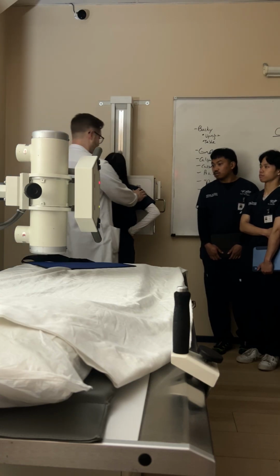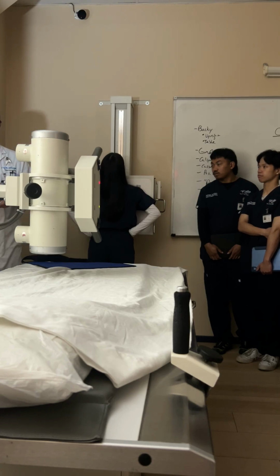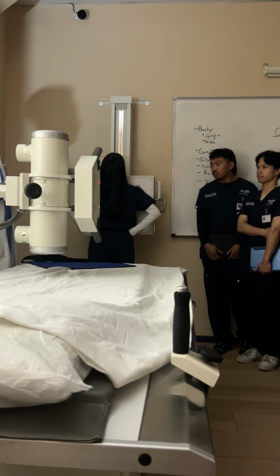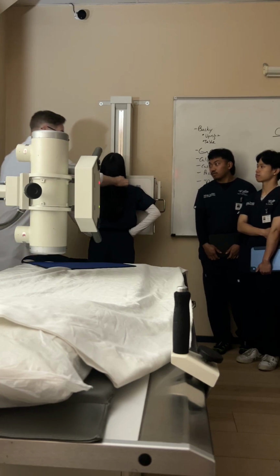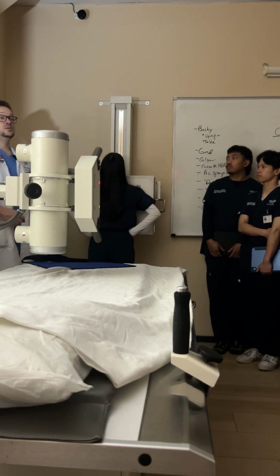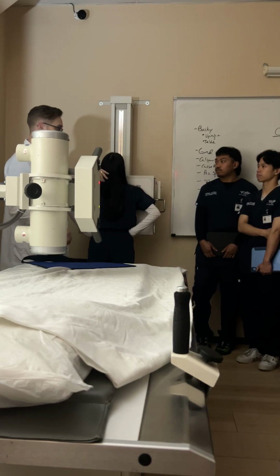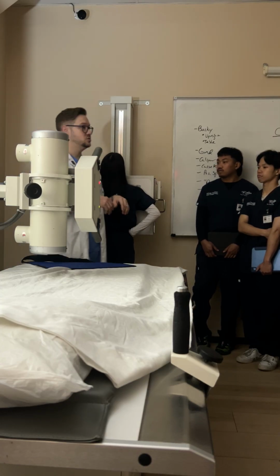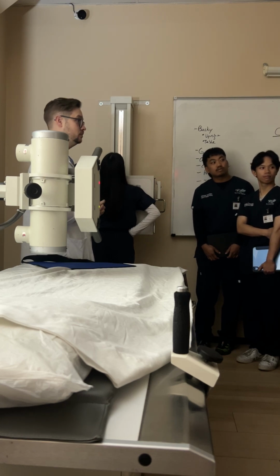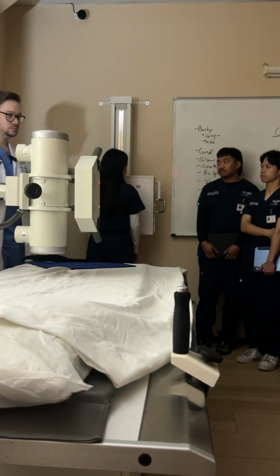Okay? I really want to make sure those shoulders are rolled forward. I want to make sure that chin is nice and high. Why do I want her chin to be high? We don't want her chin to be in the apical region of her lungs, right? I also don't want her head tilted too far back, so it's a delicate balance between the two, okay? So just make sure their head's not tilted too far back and their chin's not too far down. Yes? When you say T, obviously at the T7 level, right? Mm-hmm. Okay. And you can relax.